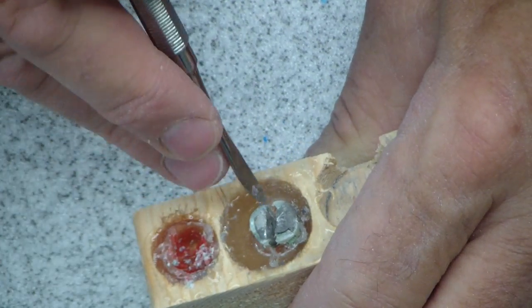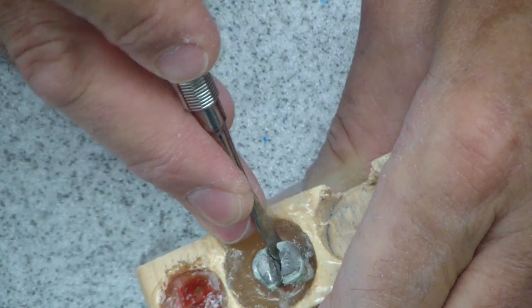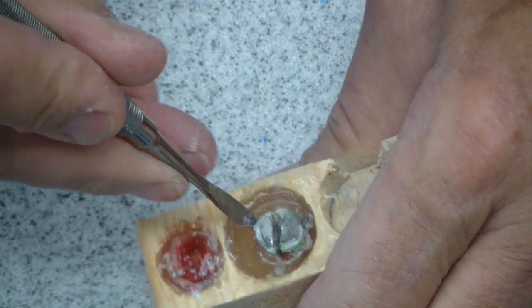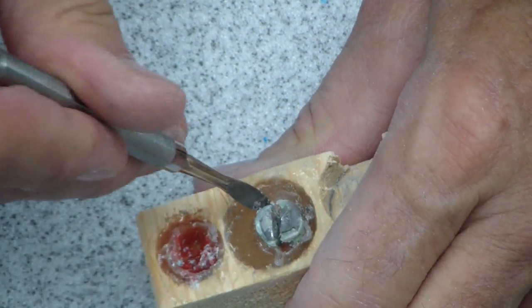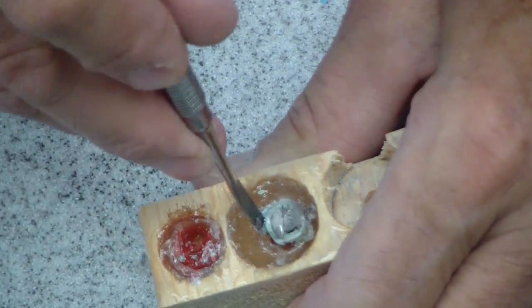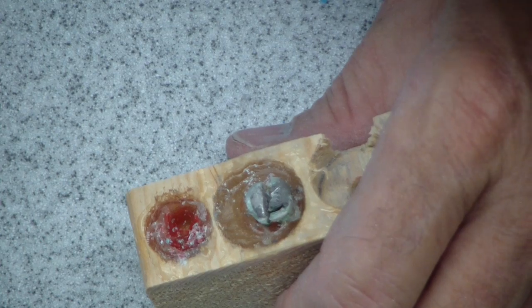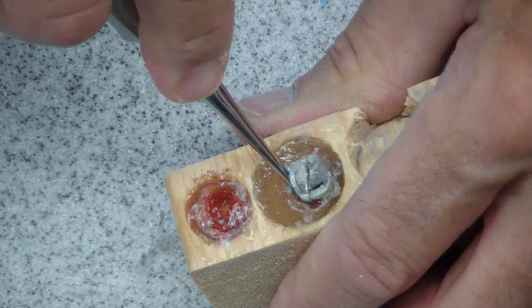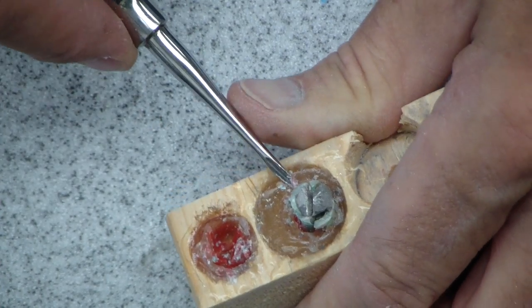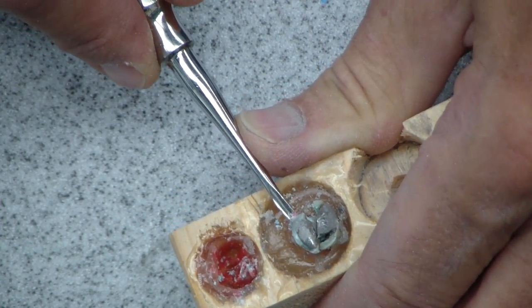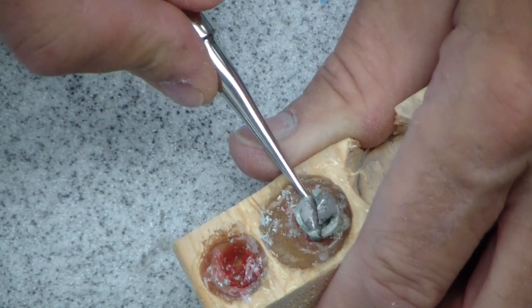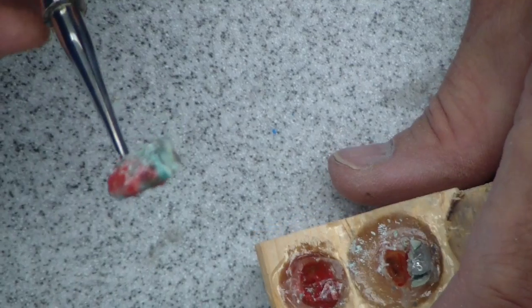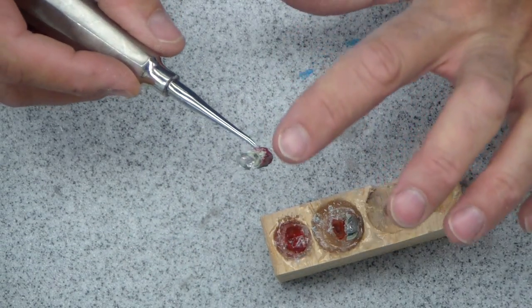The crown's starting to break up on me here a little bit. I figured out what happened. These are really dried teeth. At this point, it's just whatever elevator you like to take out these things. It's really hard to get something that exactly simulates a live human jaw. Dr. Marx's done a pretty good job of making a simulation. I've had teeth break in retreated teeth. There we go. See that split down the middle there?